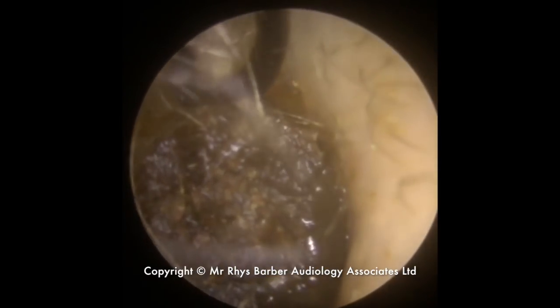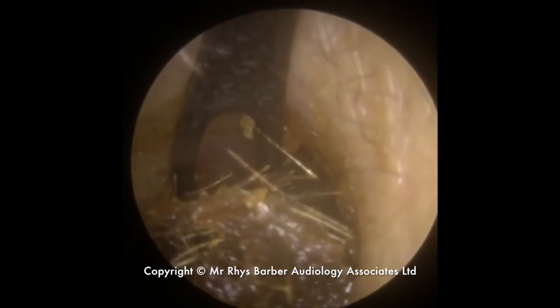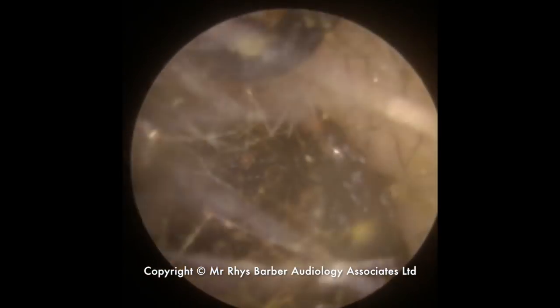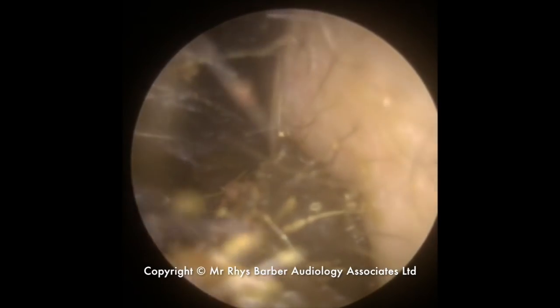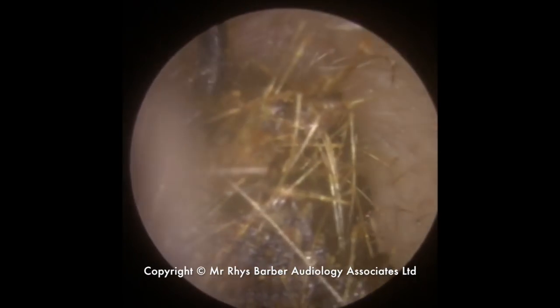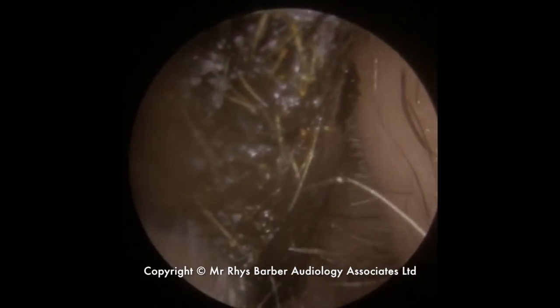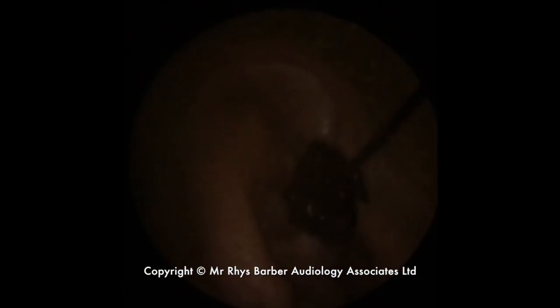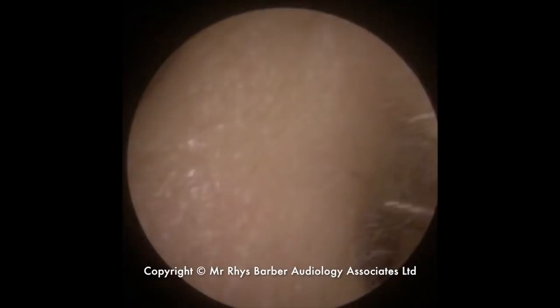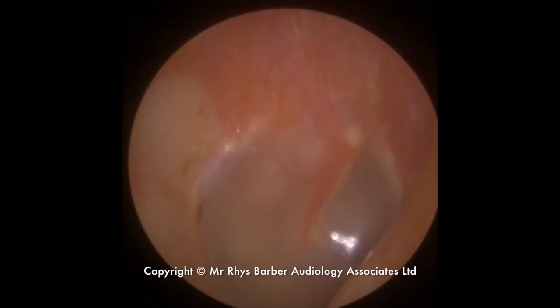It doesn't really want to come out just yet, so we're going to see if we can get behind it with the Jobson horn now. Just sliding, trying to roll — you can see this back section is a lot harder than the front section, so we're able to roll this. You can see little bits of hair in there, which you've seen on quite a few of the videos. There's that block — you can see it's quite dark in colour and quite a large piece. And there's the eardrum.